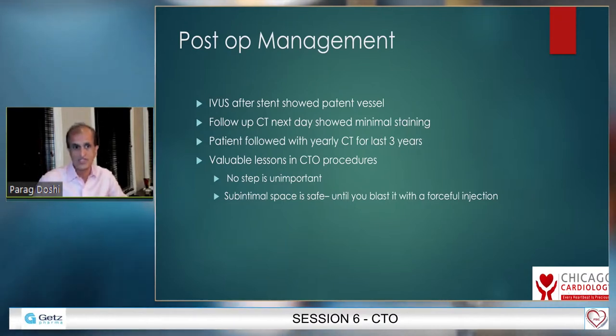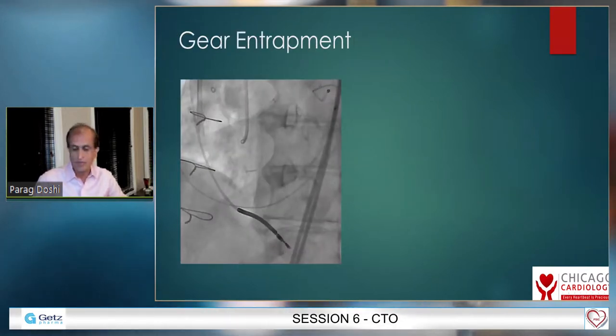The patient we followed with CT for 3 years, and this was a valuable lesson that even if you think that your procedure is over, it's not over until your gear is out and the patient is back in the recovery area. And the subintimal space is safe unless you blast it with a forceful injection. So little things matter in CTO or PCI. This is another example. 2 minutes, please.